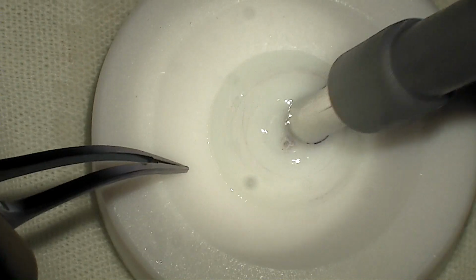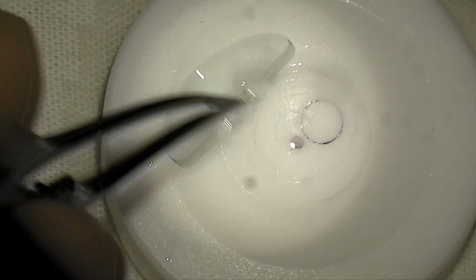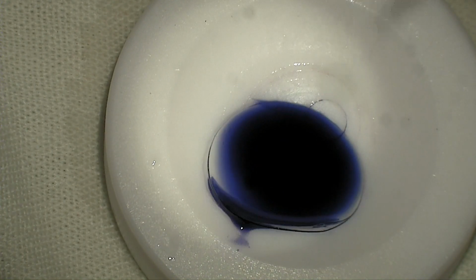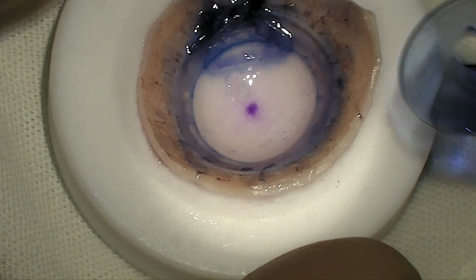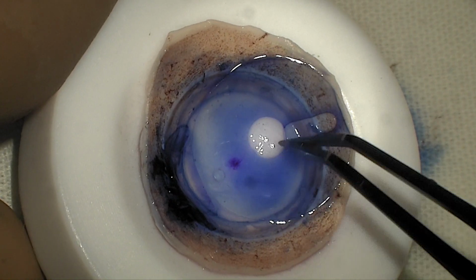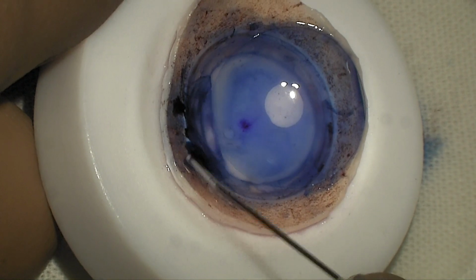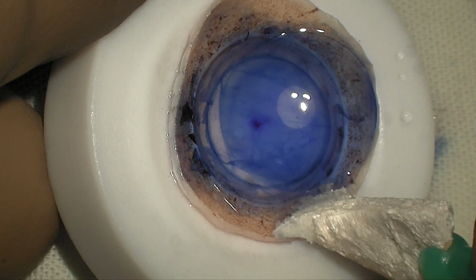A 3 mm central or slightly eccentric punch of the BCL is done. The trimmed BCL with central window is again stained with trypan blue for easier identification. This is then placed onto the stripped part of the donor corneal stroma. Very carefully, the stripped DM endothelium is floated back on the BCL surface and the water soaked to prevent it from slipping.